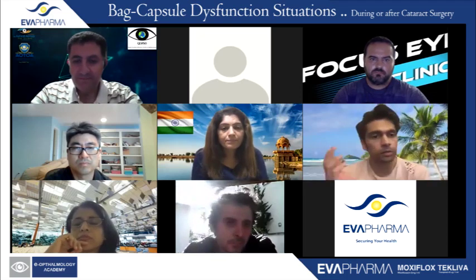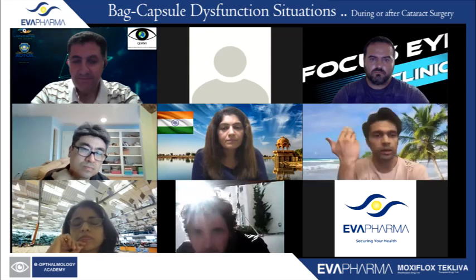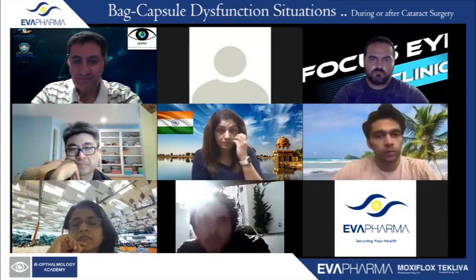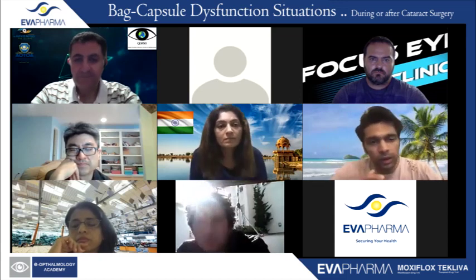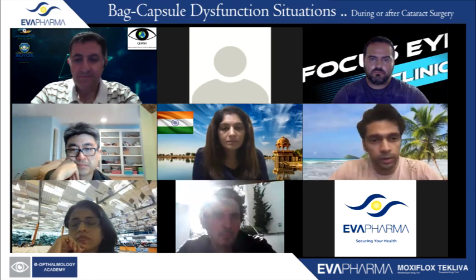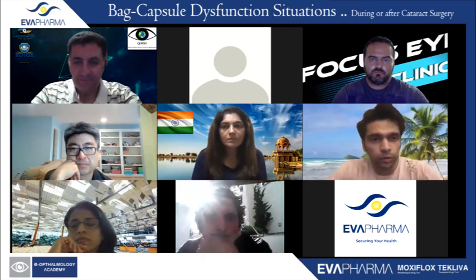I mean, what's the harm? It's just getting tucked. And if I'm tucking in more, even if the eye grows, it's growing with it. I leave it a little bit loose, just keep it a little bit titrated out, so it grows into it.